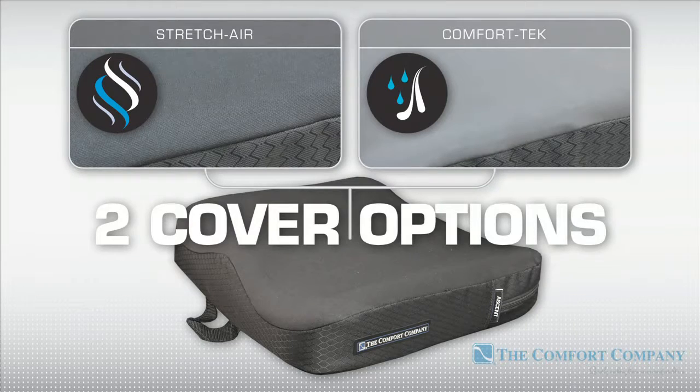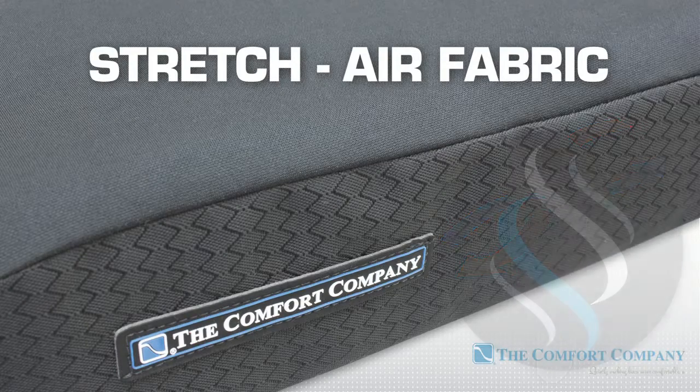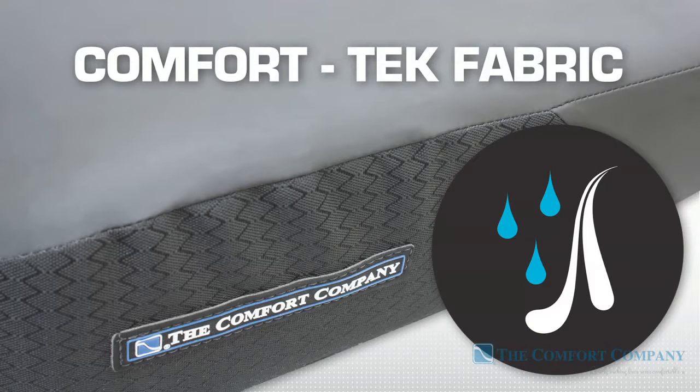Cushions are available with two different cover options. Stretch Air fabric is designed for air transmission and heat dissipation, combining a stretchy polyester top layer with a water-resistant yet breathable vapor barrier. Comfort Tech is a multi-dimensional stretch fabric with supple leather-like properties, providing an easy-to-clean surface and protection for the inner cushion.